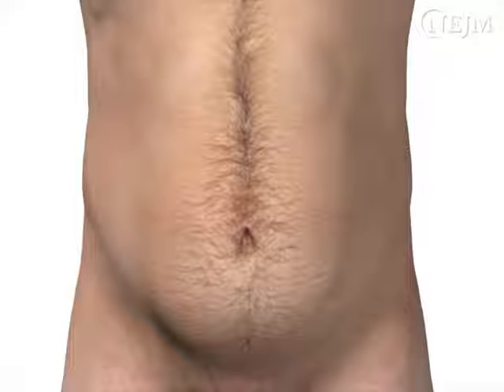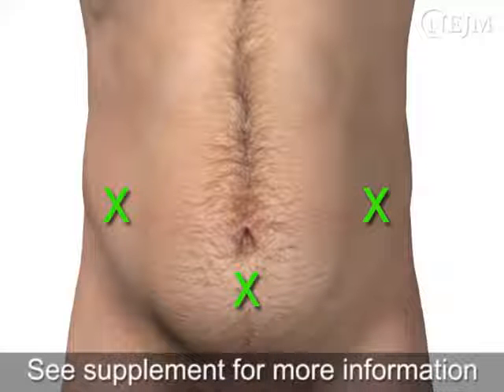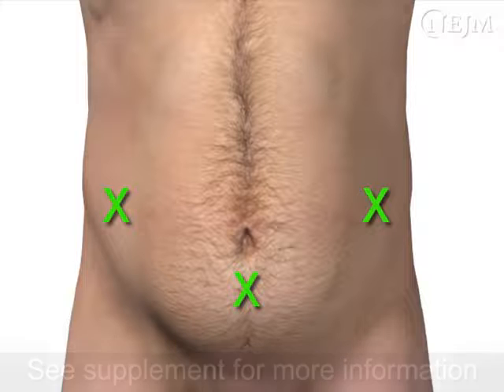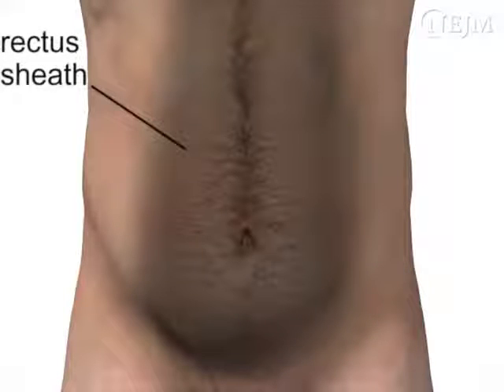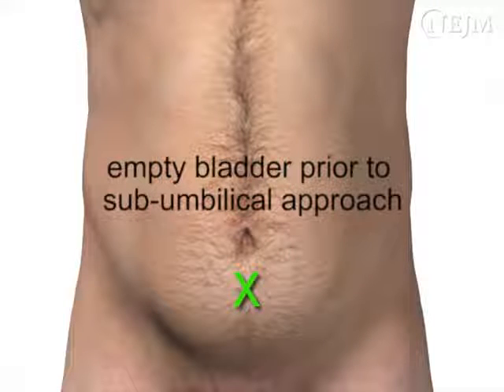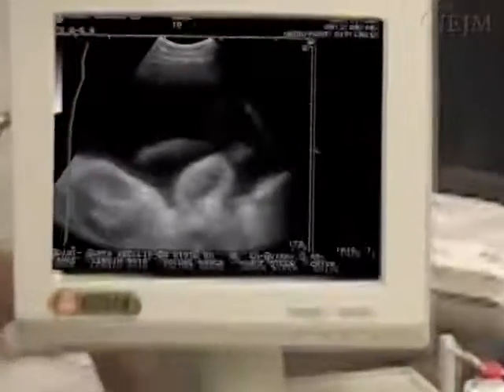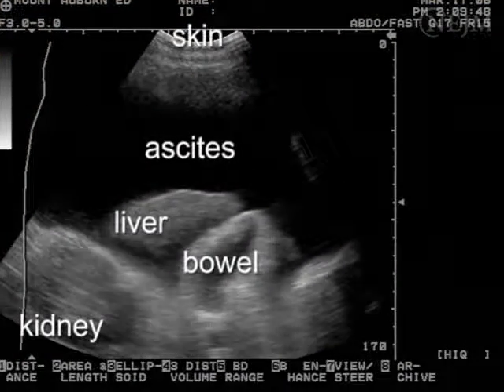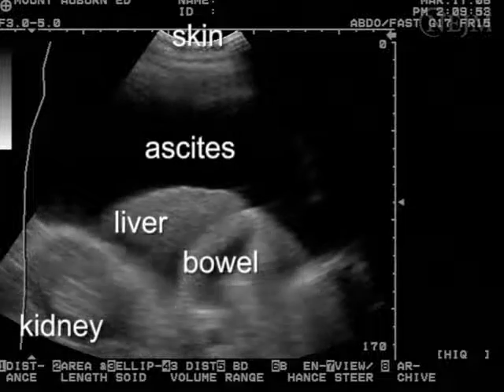Recommended sites of needle insertion are 2 centimeters below the umbilicus in the midline and either the left or right lower quadrants. If a lower quadrant approach is used, confirm that the entry site is lateral to the rectus sheath to avoid puncturing the inferior epigastric artery. If the subumbilical approach is used, the bladder should be emptied before the procedure. If available, bedside ultrasound should be used to find an appropriate location that contains ascitic fluid but is devoid of loops of bowel or solid organs.